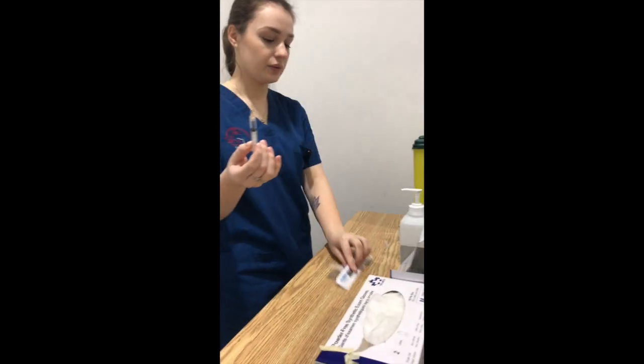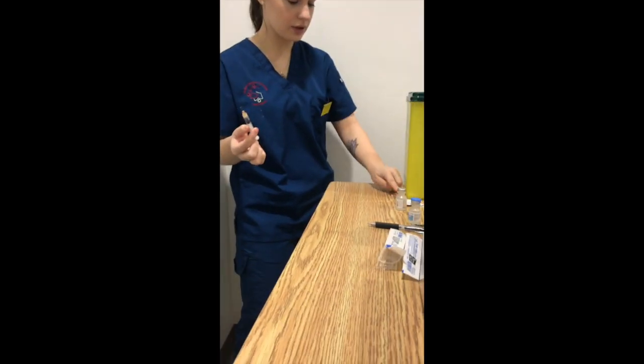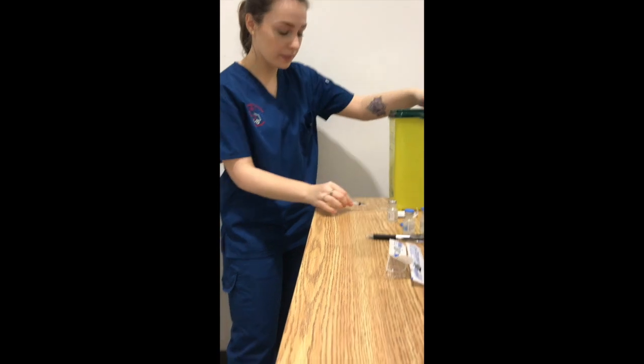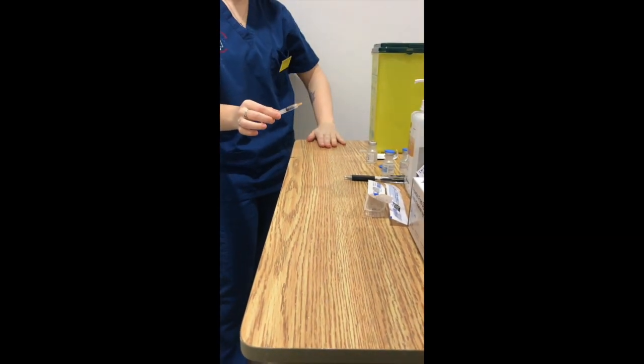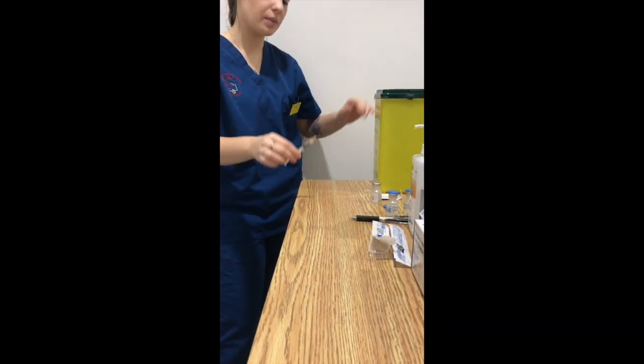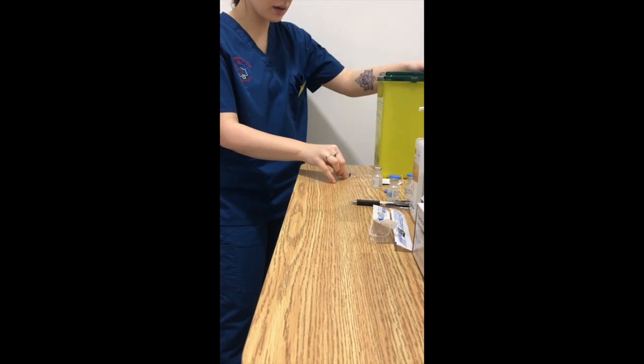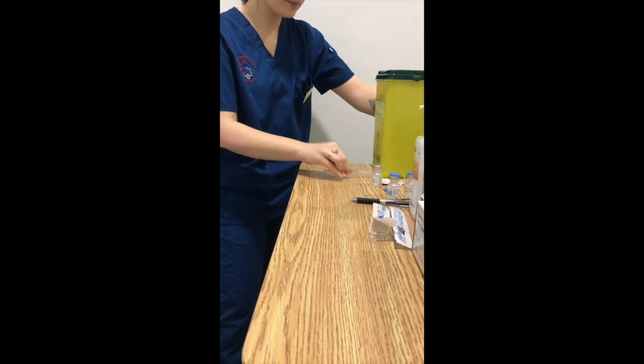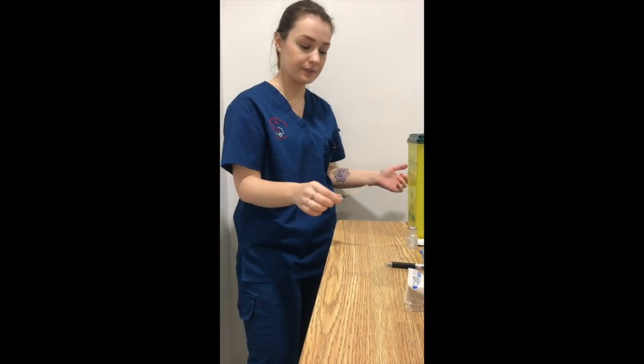So to keep safe needle technique, we're going to put the cap of the needle right against the little sharps container here so that our hands aren't putting the needle cap right back on. You want to put it on a hard flat surface, and then you need something to push it up against. So then we're just going to cap the needle right back in here and give a little push, and then it's safely capped because we're preparing the medication away from the bedside.